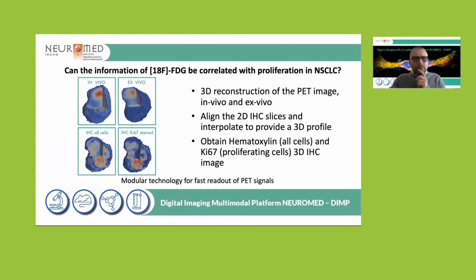Let's look better at what you can do. As we said, PET imaging is three-dimensional, it's 3D. So what you can do in vivo is reconstruct the cancer in 3D. If you compare it with the image of the cancer I've shown you, you have this sort of beam. It is possible to segment it out and have a 3D. I also opened up the image so that you can look a little at what is inside the cancer. From the image, you take the cancer, rotate it and check what is inside.